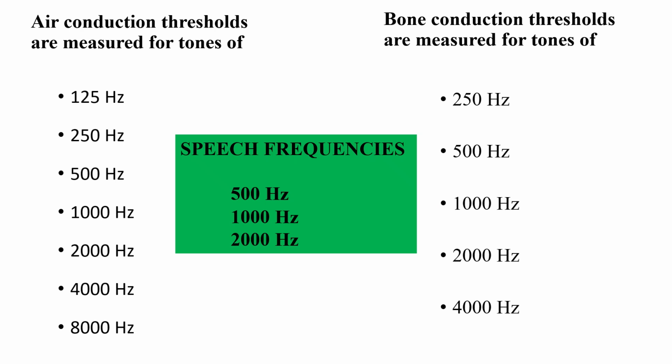The most important thing to note are the speech frequencies. These speech frequencies are very important to note, as they are 500, 1000 and 2000 Hz.